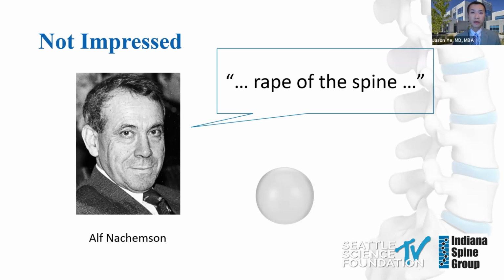He designed his own implant, which featured a silicone ball. This had improved viscoelastic properties that allowed motion and also a cushioning effect. Unfortunately, his cadaveric studies found that this device disintegrated after 20,000 cycles of load and was not appropriate for human use.